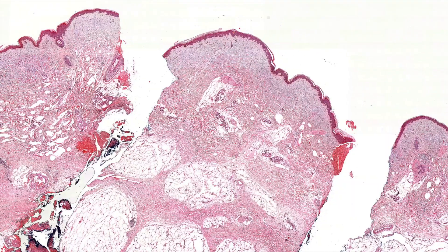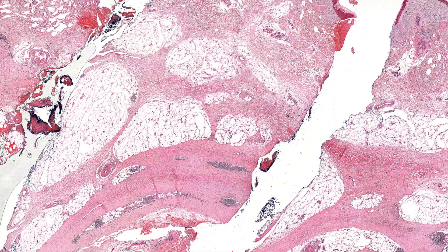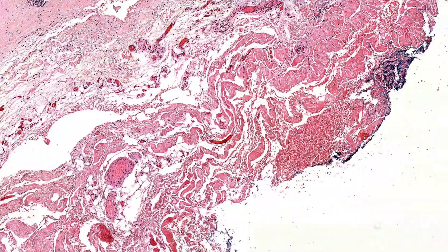So the epidermis, dermis, and even the upper part of the subcutaneous is pretty normal. Then as we get down, you start seeing some thickening and sclerosis of the subcutaneous septa. The lobules may have a little touch of necrosis and some inflammation, but really not too bothered. The septa are getting thickened, and then here it's really thickened and very layered sclerosis.